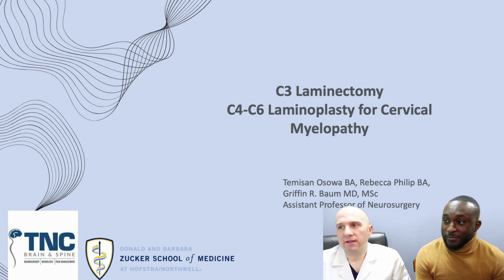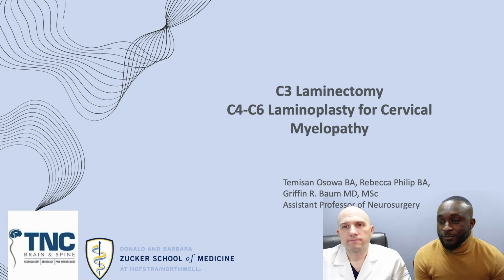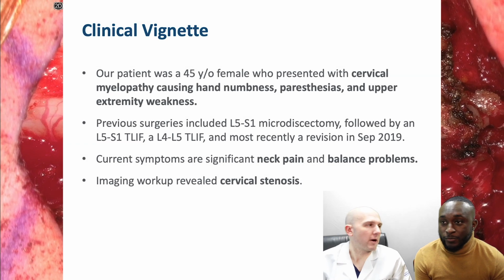Tell us what we're going to be talking about today. All right, we are going to be talking about a patient where we did a C3 laminectomy with a C4 through C6 laminoplasty for cervical myelopathy. Tell us some more about our patient.